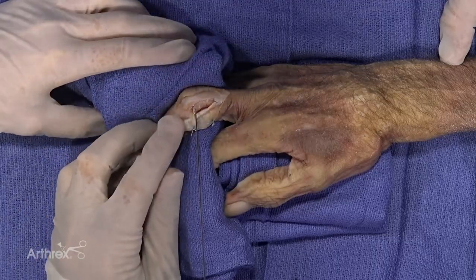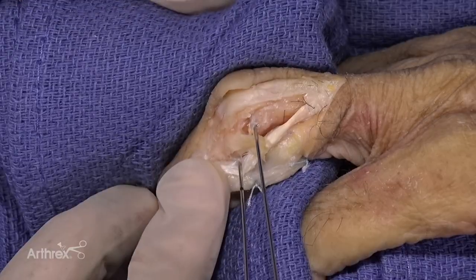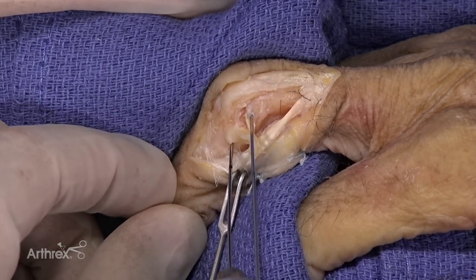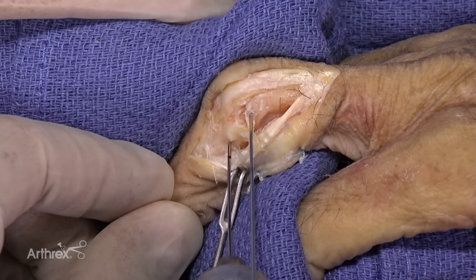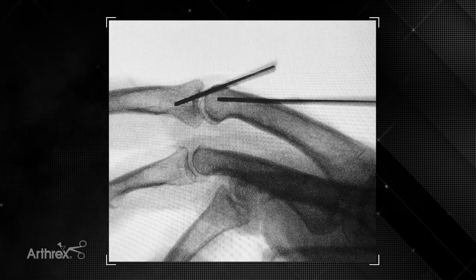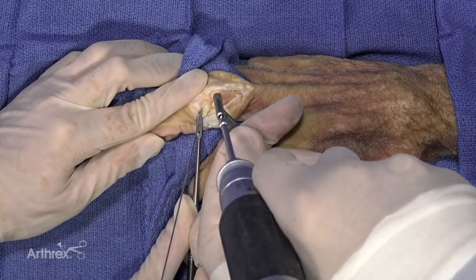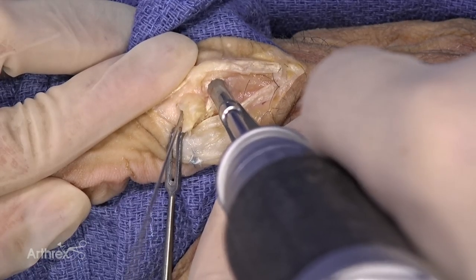Then on the distal pin, I've made a space just distal to the collateral ligament and made a small opening where I'm going to be able to put this in so that we don't get any soft tissue intertwined. This is just near the distal edge of that footprint, around the middle phalanx. Again, we push that right down to the black laser line. We're going to show what that looks like as we check our position for the K wires on the fluoroscopy. Okay, now we'll take our 2 millimeter drill bit again. You have a 2.2 and a 2.0 drill bit, depending on whether the bone is hard or soft. And again, the depth gauge causes a stop so that you don't drill too far.